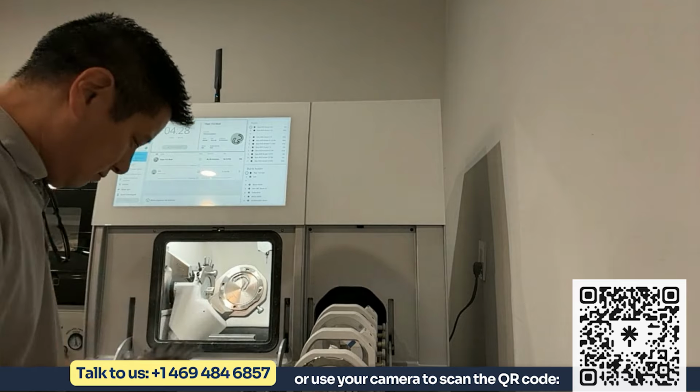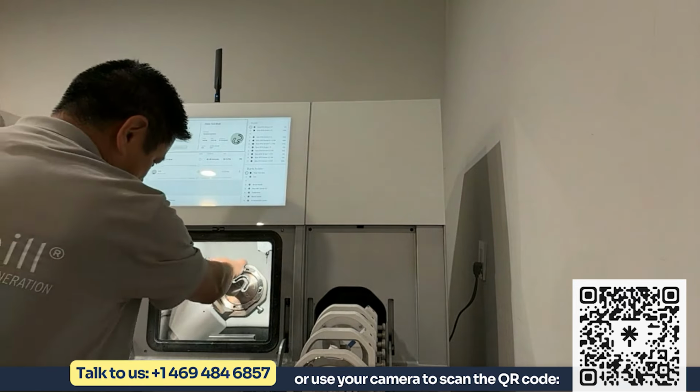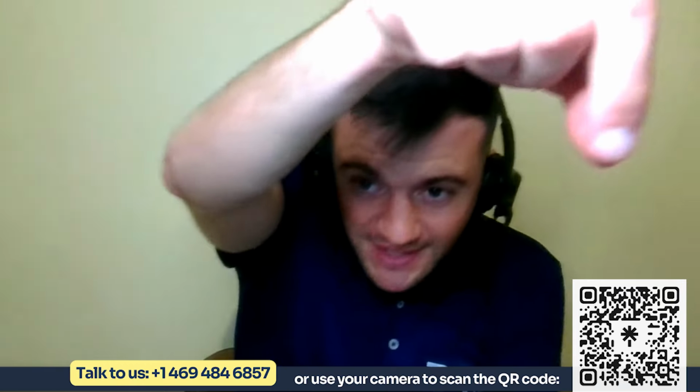And such a nice feature. Yes, those of you who don't know how nice it is until you've had to do it manually. We used one. Yeah, until you lose a couple burrs trying to stick your hand inside the mill, place it there, maybe break a burr. It happened sometimes. I've done it, yeah.